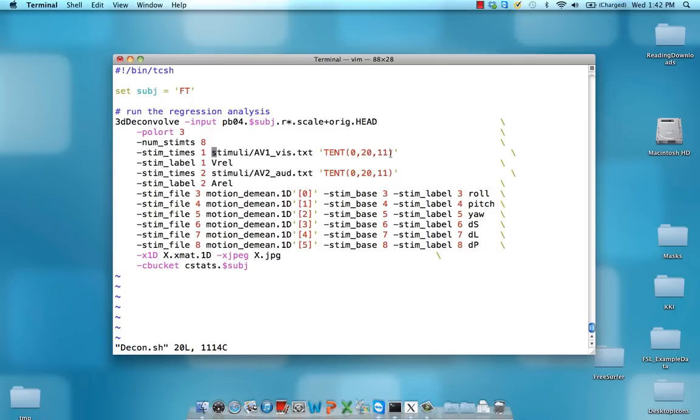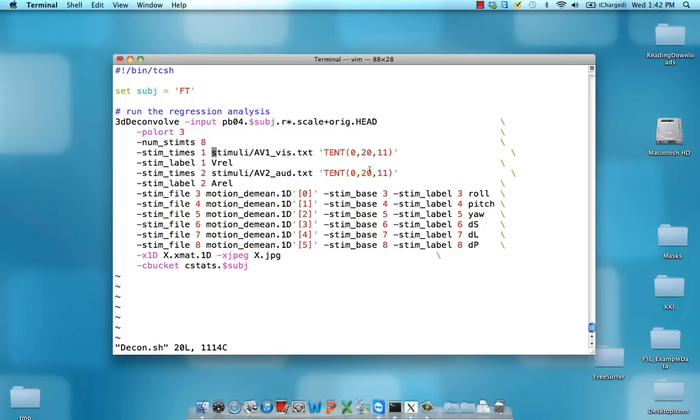It requires three arguments. One is where do you want to start this time window, where do you want to end it, and how many knots or how many time points do you want to estimate.